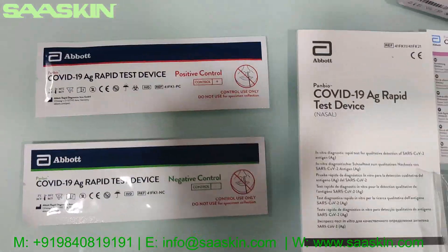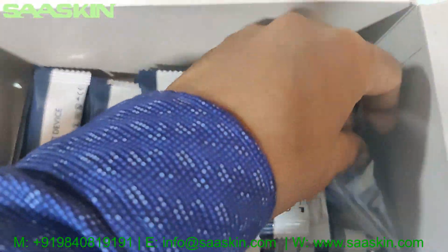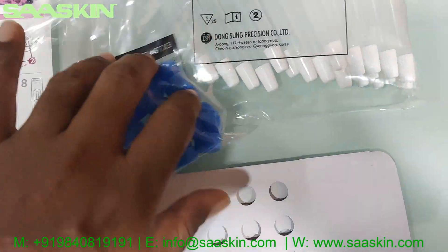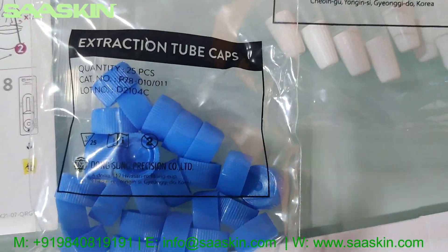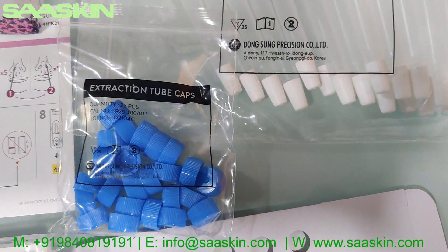You have the positive and negative control swab sticks, and you also have the extraction tube caps — 25 of them. I've shown you the tubes and the corresponding caps for those.